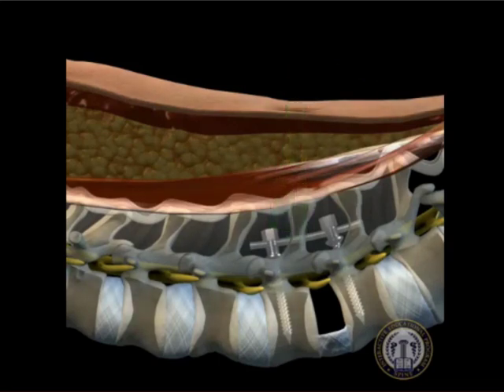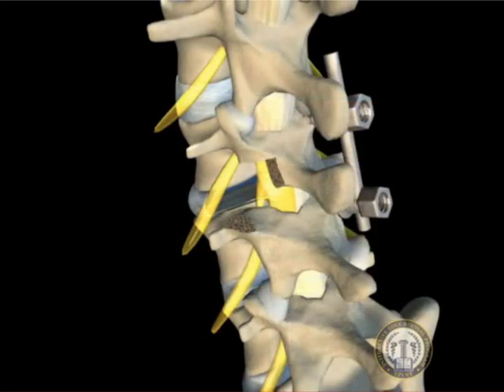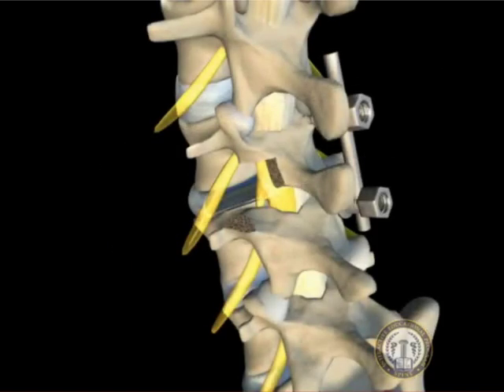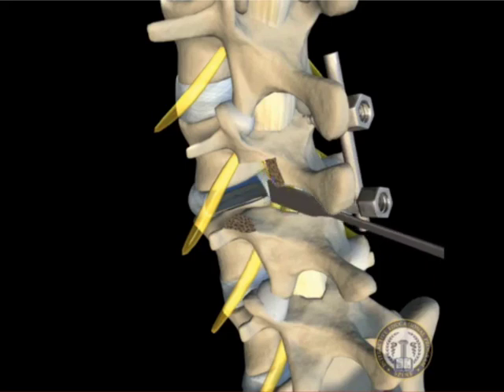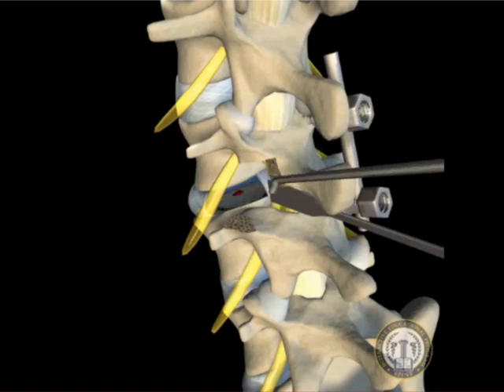Once the optimal interspace distraction has been achieved, end plate preparation is performed using a series of down-pushing curettes and end plate scrapers. A small retractor is used to protect the traversing nerve root, and the exiting nerve root may need to be slightly elevated if performing an L5 to S1 fusion. The cartilaginous end plates are then removed, the bony end plates are decorticated, but left structurally intact.